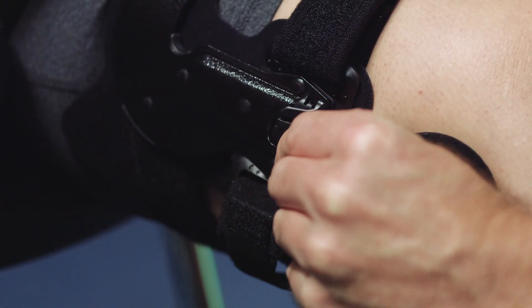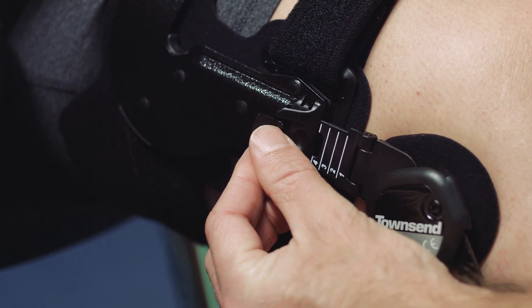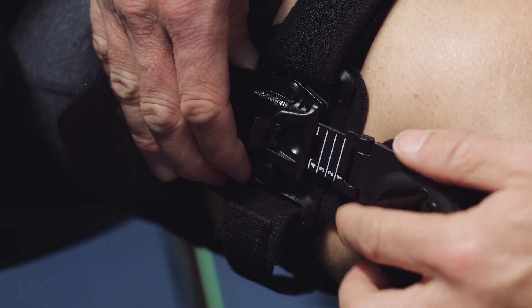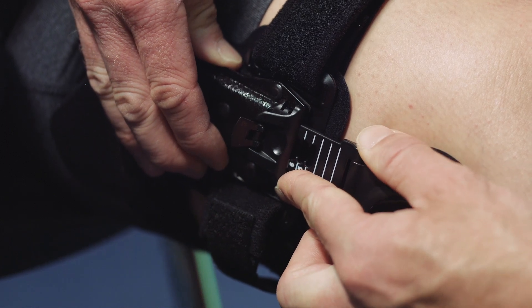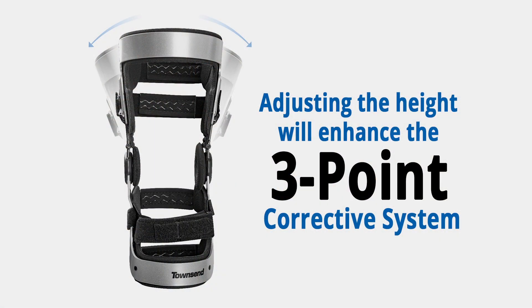If the patient's thigh length allows, with the thigh straps unattached, lift and release the snap lock lever on each of the load shifters and extend the thigh portion of the brace upward equally on each side. Note that adjusting the height of the thigh band beyond mid-thigh level will enhance the mechanical advantage of the three-point corrective system.